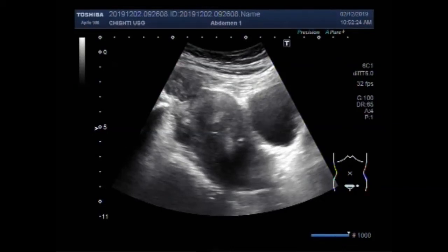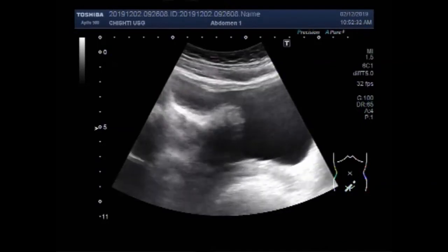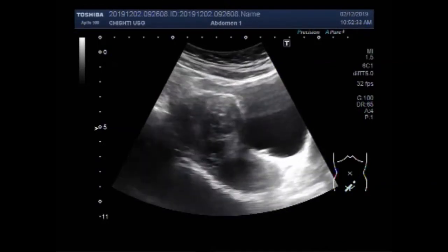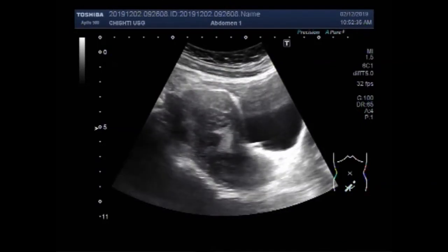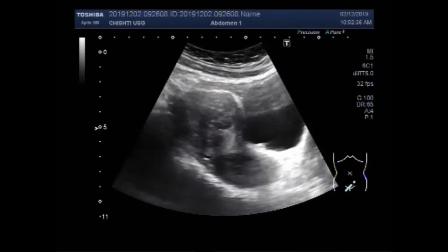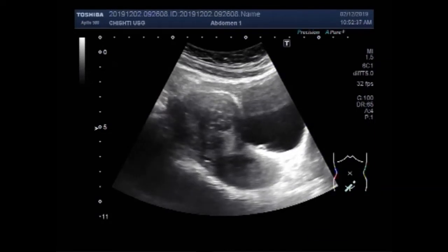Dear viewers, I hope you are all fine. This ultrasound video shows multiple fibroids in the uterus, with a mass in one ovary and a cyst in the other ovary.